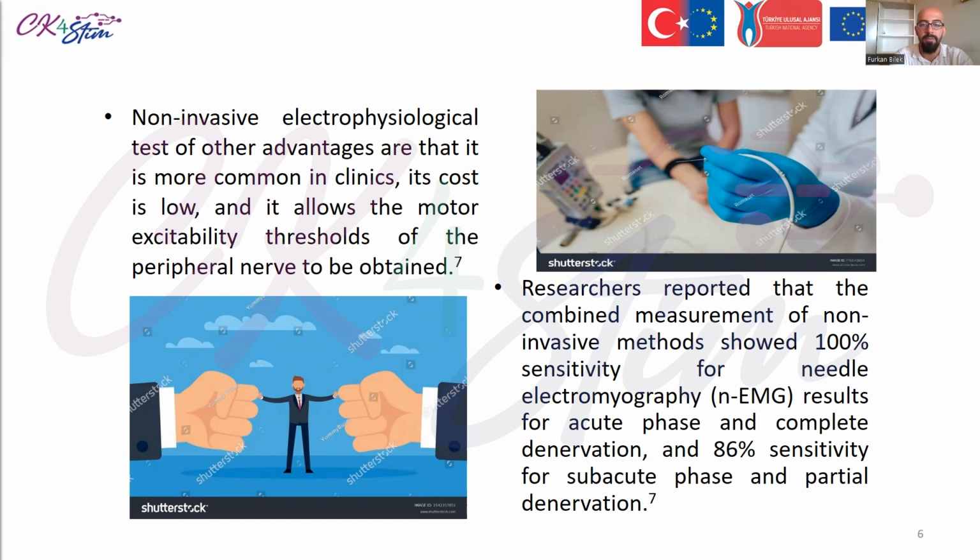100% sensitivity for the needle electromyography results for the acute phase and complete denervation and 86% sensitivity for the subacute phase and partial denervation. There are a limited number of studies in the literature investigating the relationship between invasive electrophysiological tests and non-invasive electrophysiological tests.